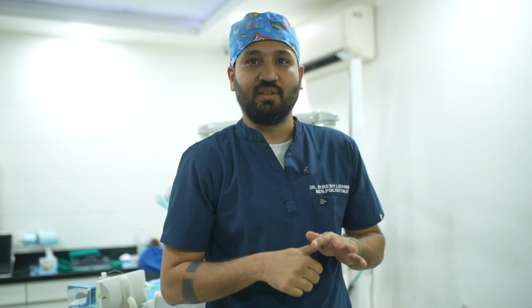Okay, so we did the face scanning with the Shining 3D face scanner. It's a Matty Smile. Why have we done it? It's a denture based case, so we want a jaw relation of the patient. We are going to take a face scan at a normal relation in which the patient is in maximum relaxation, and then we will give him a wax bite and again take a jaw relation. This is how we take a face scan the second time.